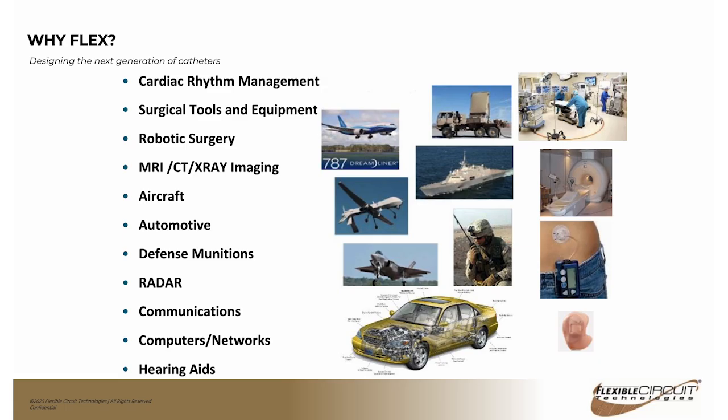They did it mainly because when they were doing the first cardiac implants, the devices were really big. It was like getting a color TV installed in your chest. So as the engineers worked to shrink those devices down, they looked at what was taking up the majority of the volume, and they found that much of it was coming from wires and from the batteries. They looked at both of those options, and they found that by going with flex circuits, they could get rid of a lot of those wires, and that allowed them to get down to the current sizing, which is about the size of a pack of Tic Tacs.